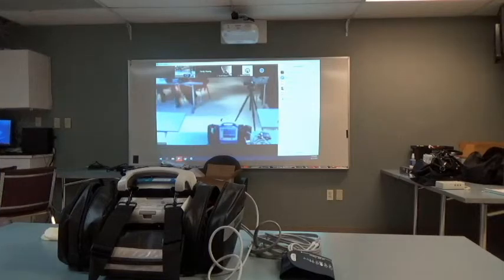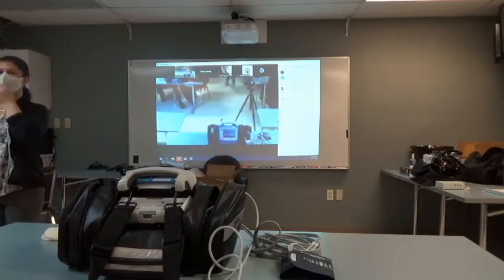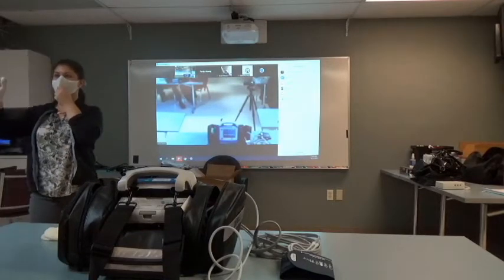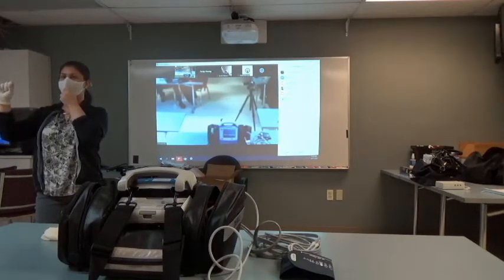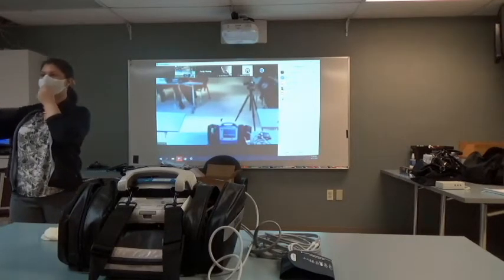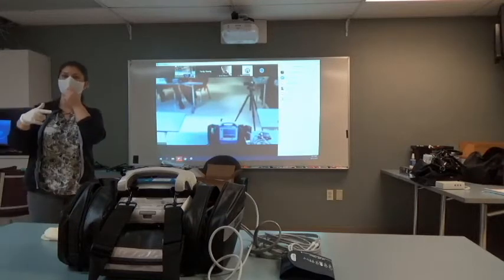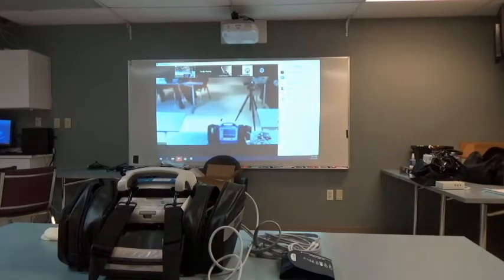Okay. For those of you that printed out your snapshot, if you take a look at your printout, you should have a camera symbol down at the bottom. The camera symbol is the exact moment that we press that snapshot key. Before the camera symbol is 12 seconds, and afterwards is another 12 seconds for a 24-second strip. Thank you very much.